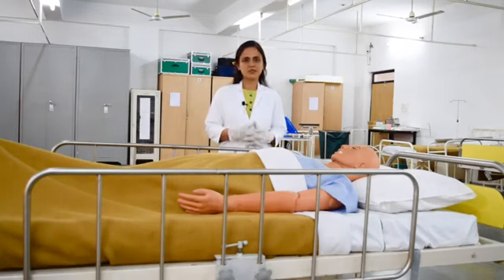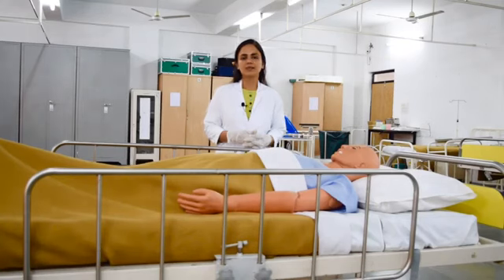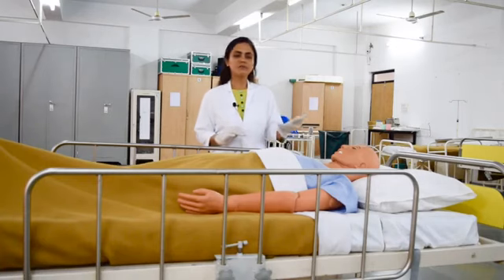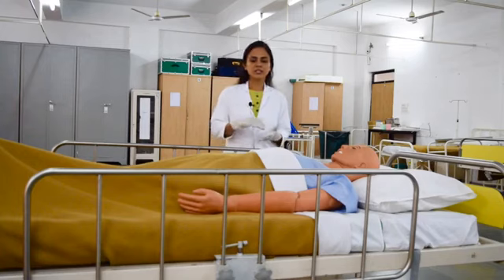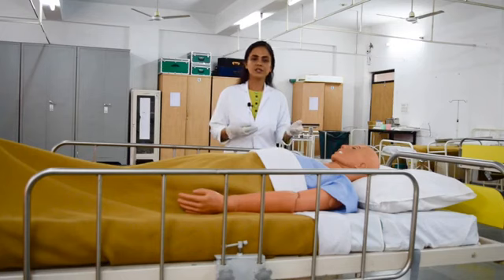Before starting this procedure, a few points we have to keep in mind. First, do the hand wash. We also have to ensure the privacy of the patient. For that we can place a screen over here. While exposing the patient, we have to take care that he or she should not feel dropped.